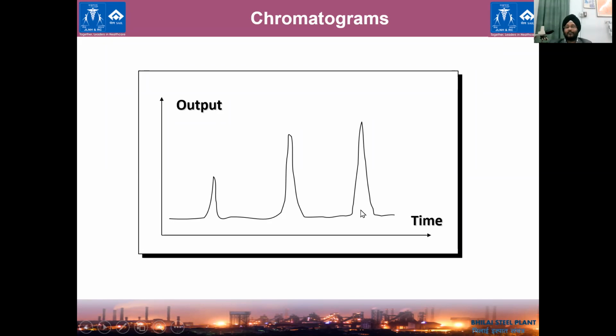Now, this sickle cell window does not necessarily have only sickle hemoglobin. It may have other hemoglobins also. So how do we differentiate them? That we'll see along the course of our talk. So this is the peak. This tells us about the percentage.